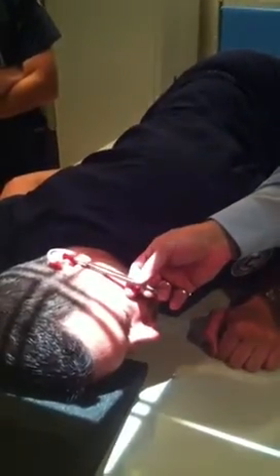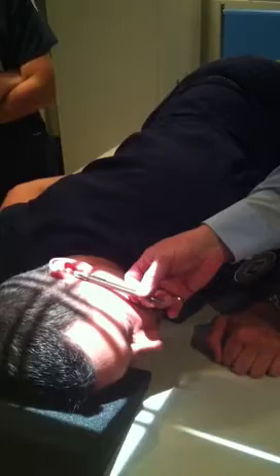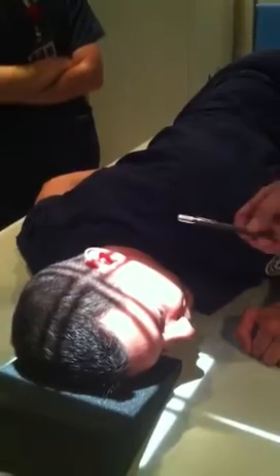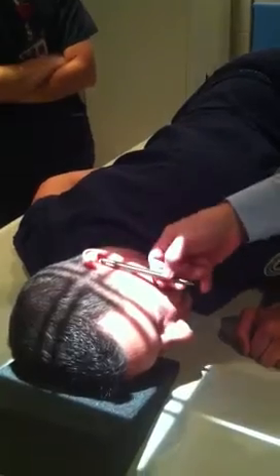Okay? Now here's a little trick. Here's a little cheat. Until you get that good eyeball line of sight, anything that resembles a straight edge. Okay? That pencil is perpendicular to the front edge. That's aligned with his IOML, and it's perpendicular to the front edge of the image receptor. So just grab you a pencil, throw it up against the patient's body part at whatever line of reference we're using, okay? And is it appropriately aligned to the front edge of the image receptor, the surface of the image receptor, okay? You use your hand too. As long as your hand doesn't curve funny.